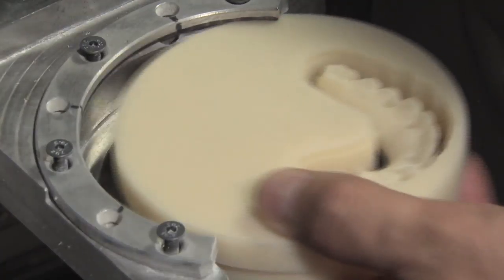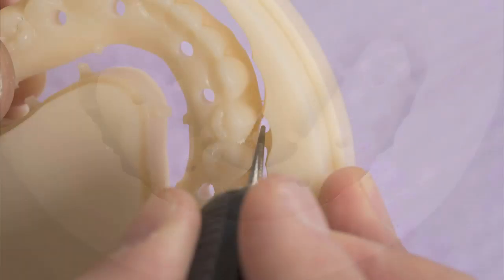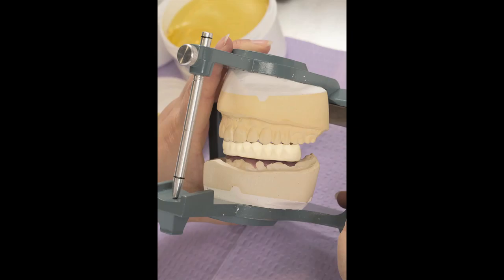Following milling, the provisional prosthesis is removed from the PMMA block. A handpiece is used to first remove the sprues from the provisional prosthesis and then touch up the incisal edges and gingival areas in order to achieve desired aesthetics. It is then mounted onto the articulated MasterCast to verify proper fit and occlusion.